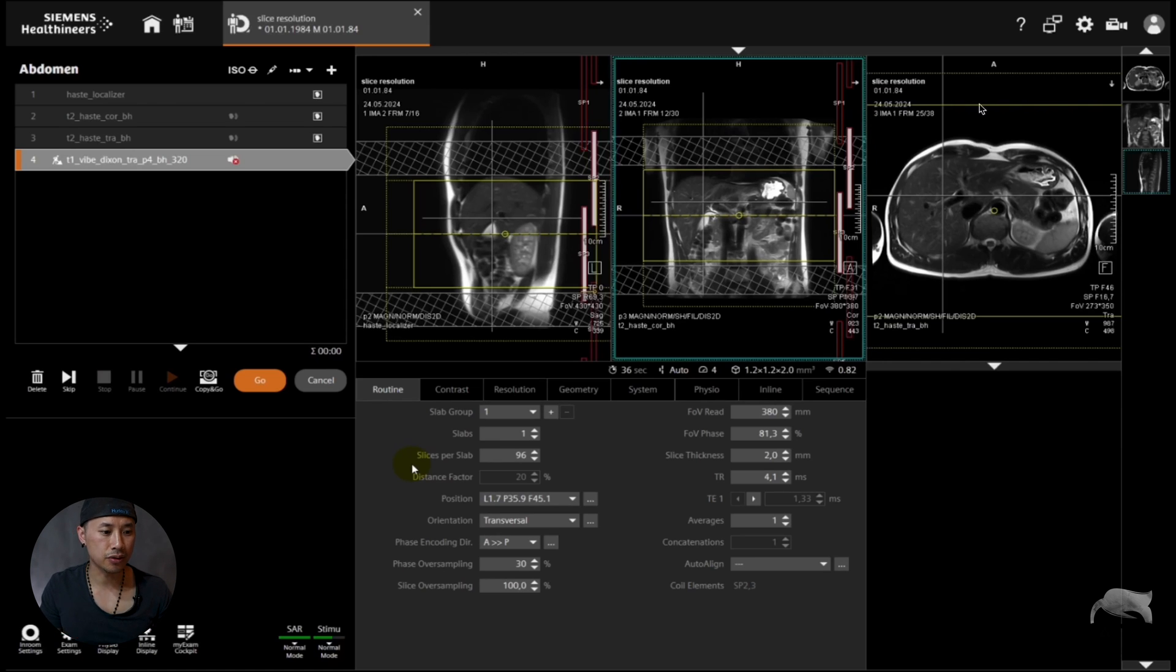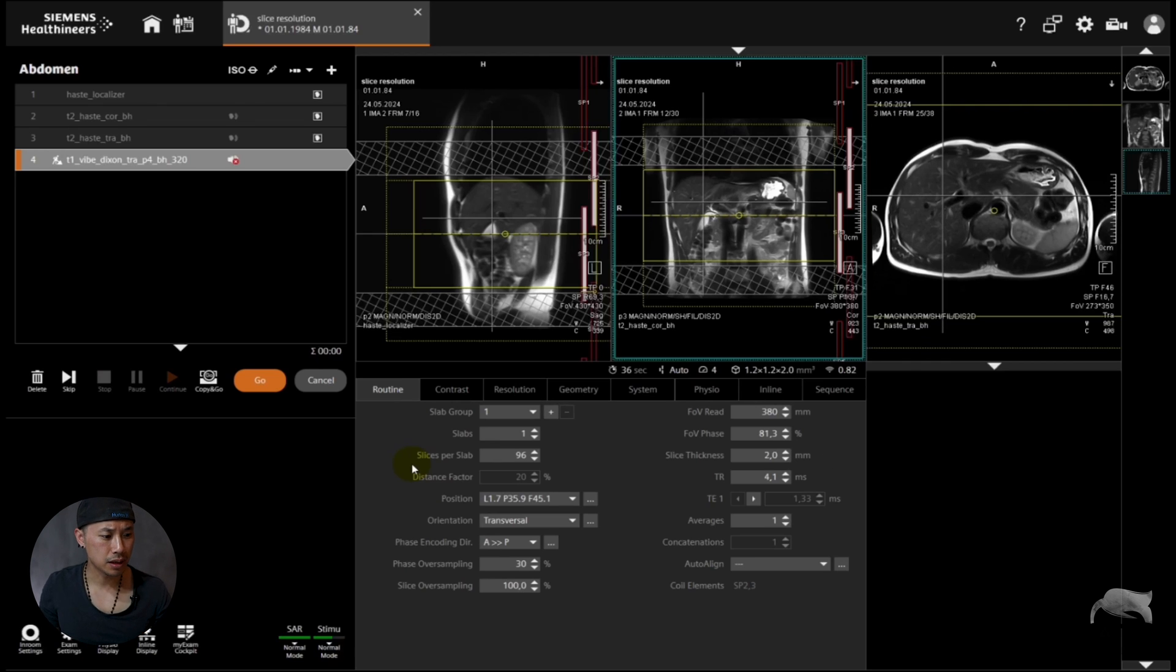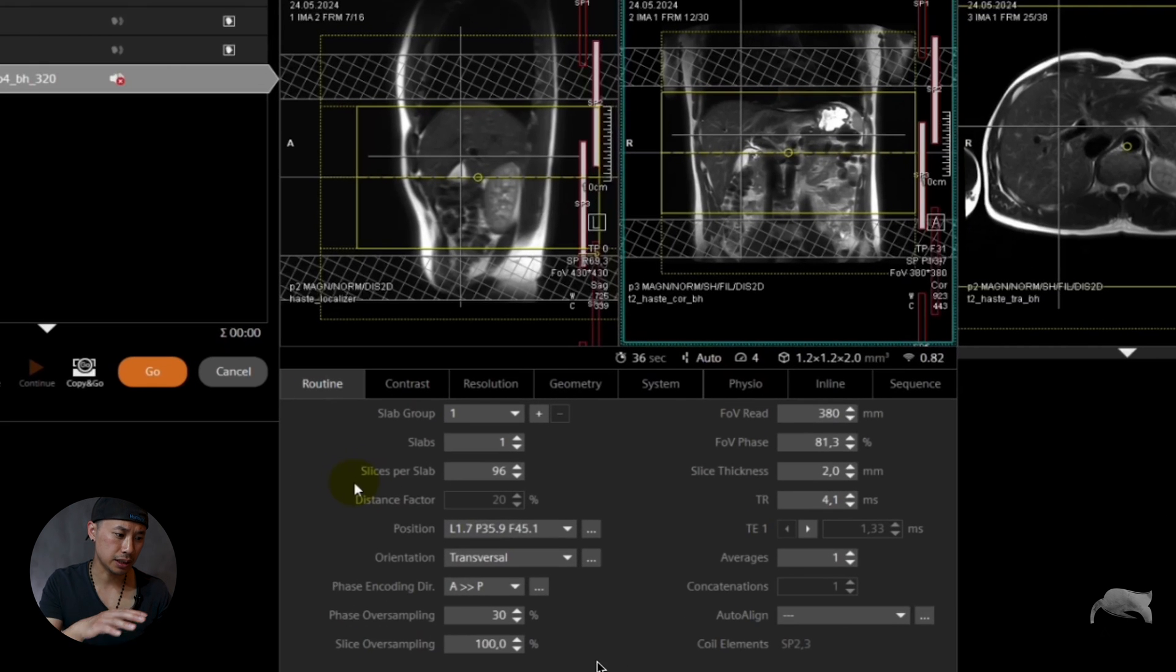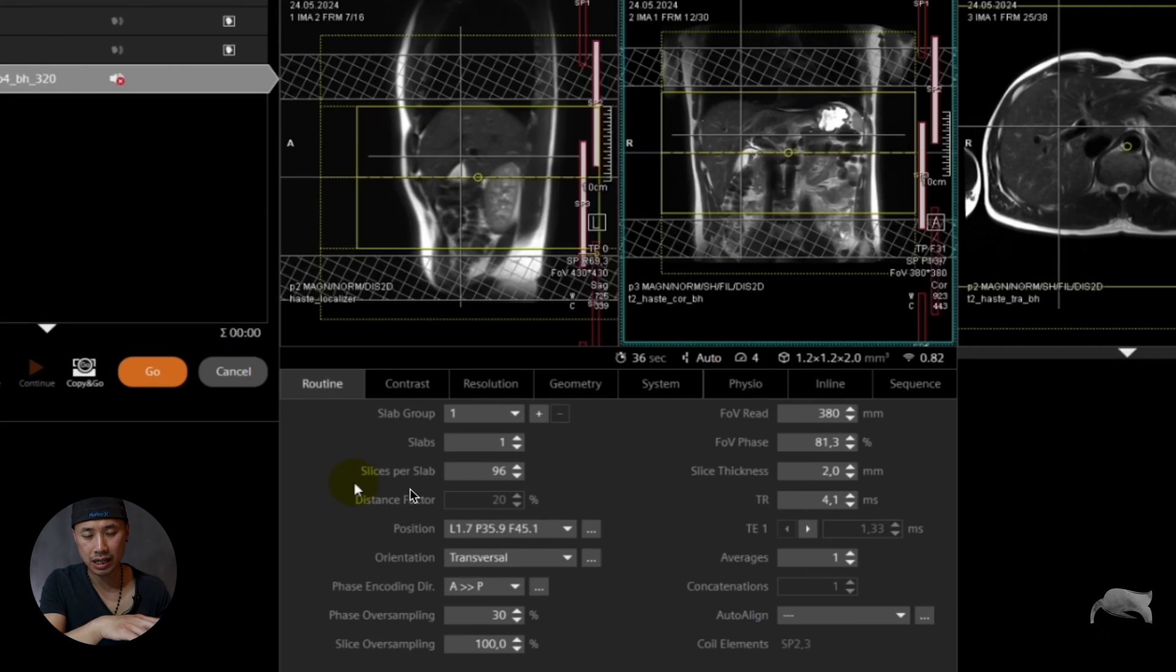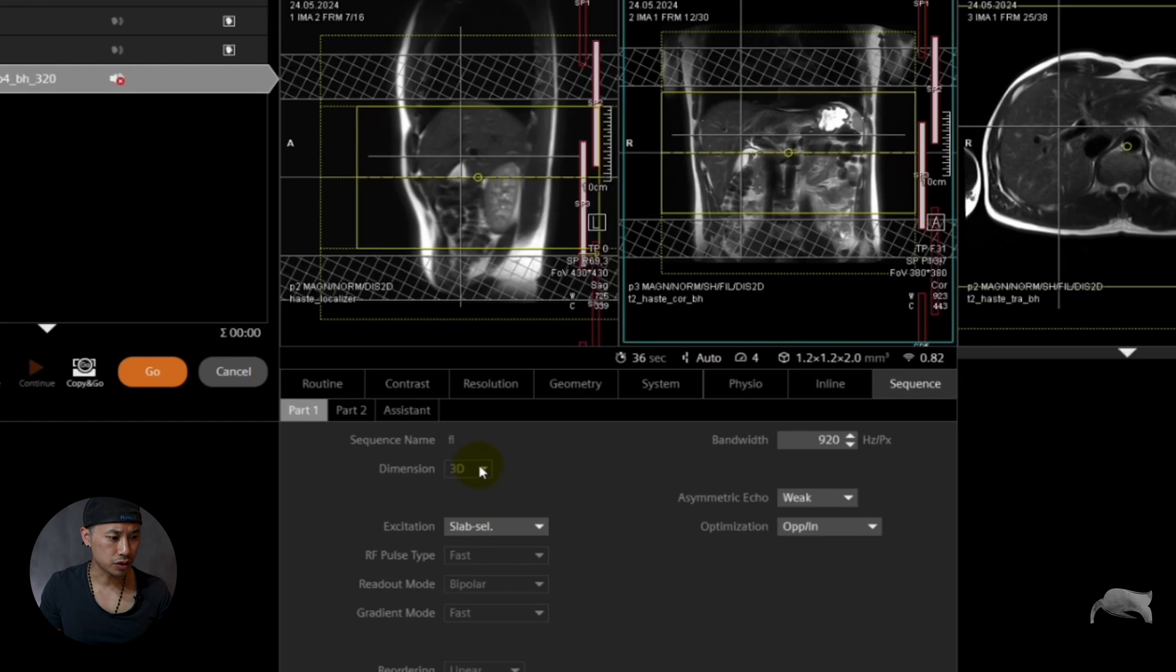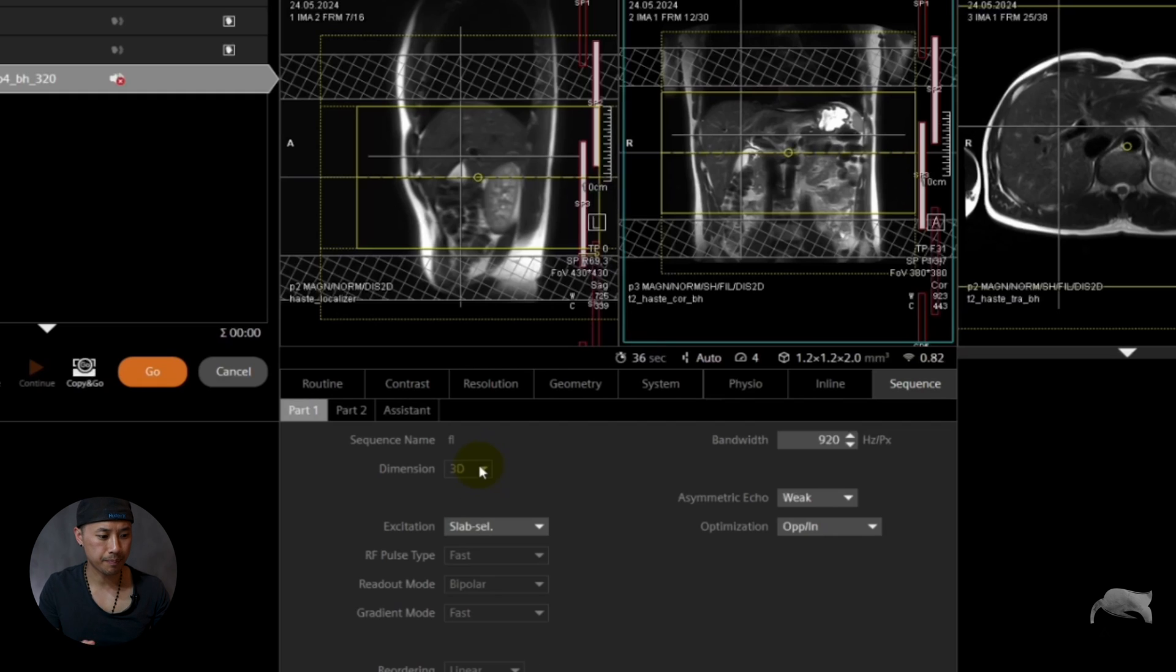So two things you need to think about. And how do you know it's a 3D? Well that's one reason you can see it's a 3D. Slices per slab is another reason you can see it's 3D. And if you go to sequence you can also see here the dimension, it says 3D.